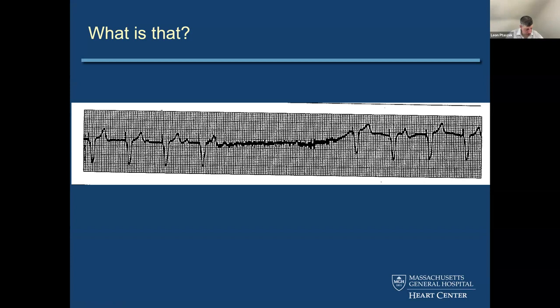So this is something that you need to keep your eyes out for, and that is the presence of electromagnetic interference that can inhibit pacing, because this fuzzy noise leads to signals of an amplitude that may not be very high by your eye or my eye, but it may be sufficient to be sensed as a ventricular electrogram or an electrical signal which the pacemaker's programming interprets as being a natively conducted beat. So it pauses on pacing.